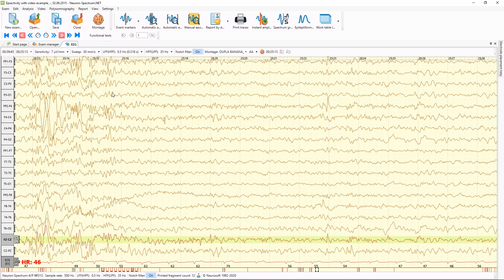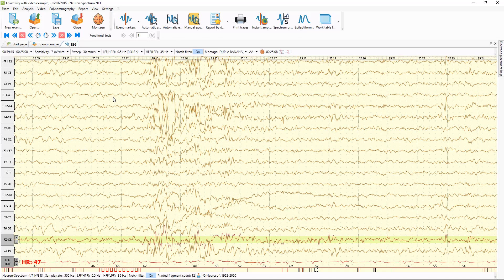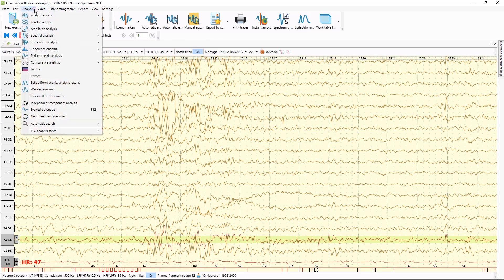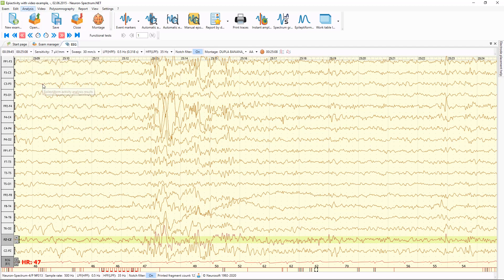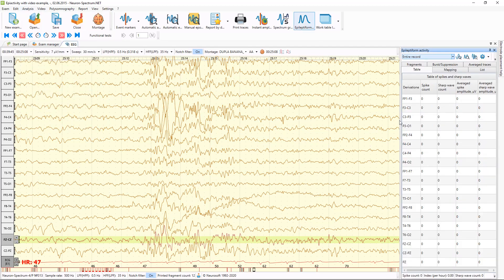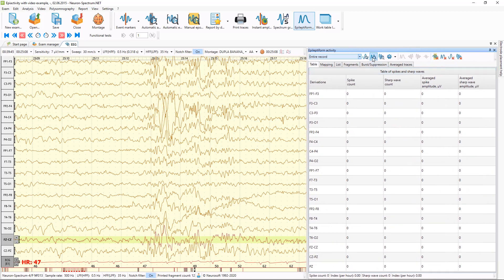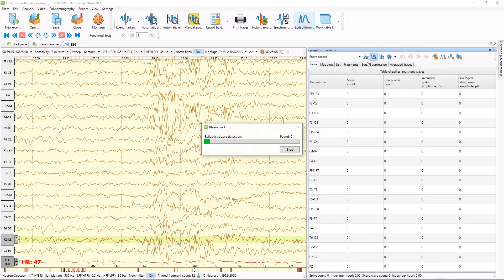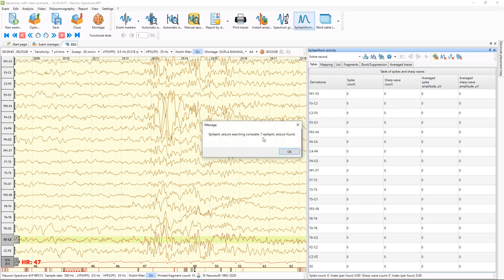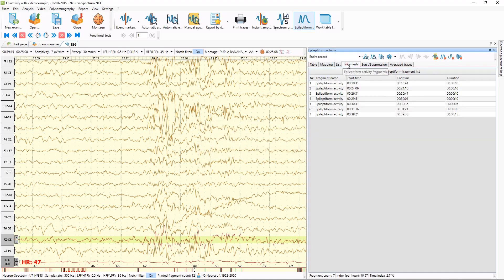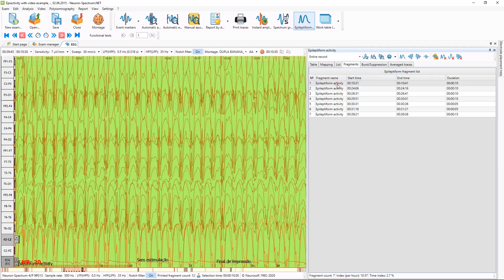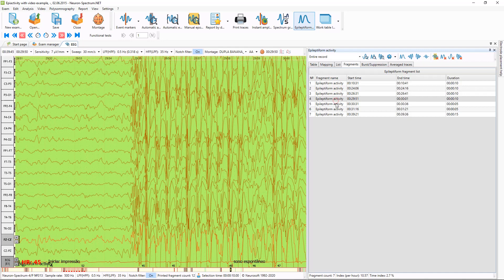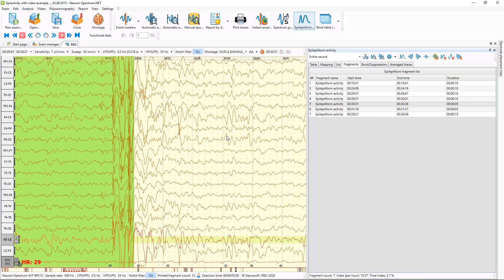Now let's see how to analyze such an examination. I will show you how to manage epileptiform activity. Using this window, we can start the epileptic seizure detector, which will automatically mark all epileptiform activity in this examination. You can see that 7 epileptic seizures were found. In the Fragments tab we can see all of them and navigate between them with a mouse click. I can review each of them.